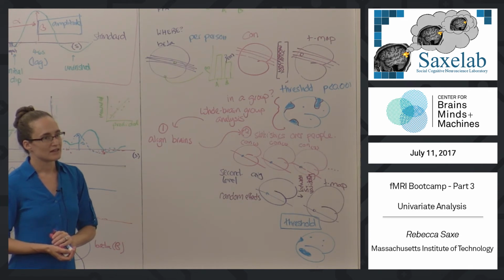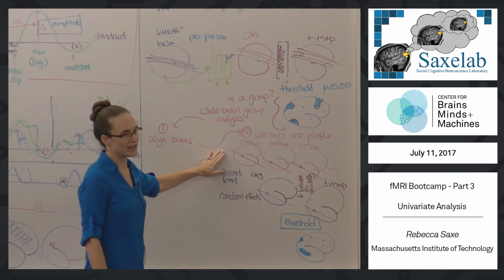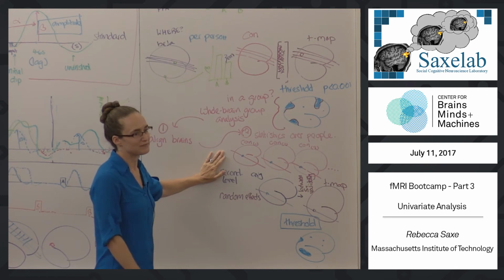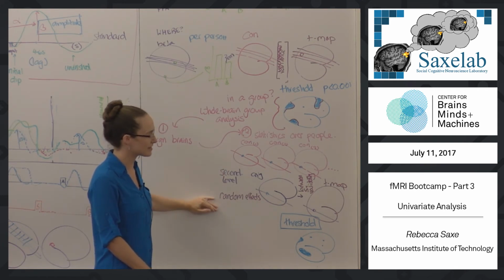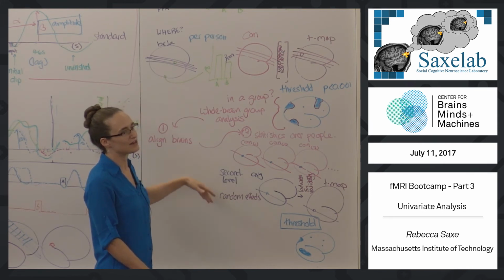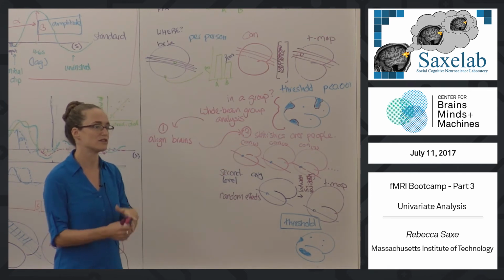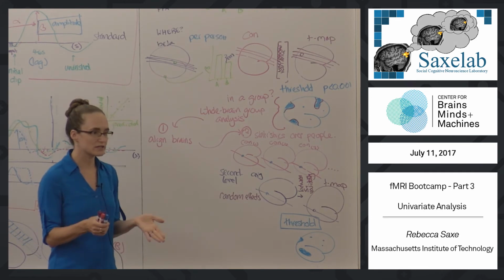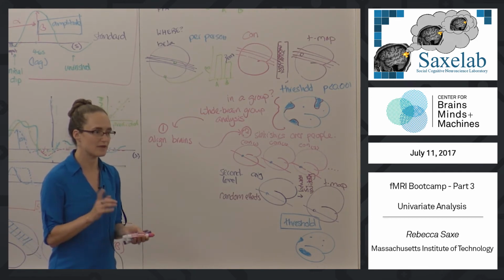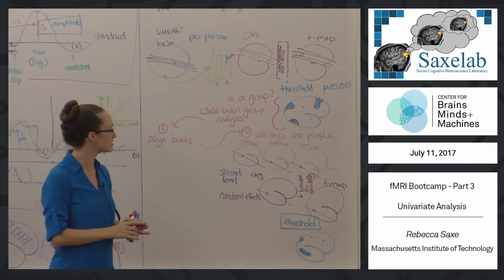This is another question that we answered in that class N years ago. And the answer turns out to be basically that cons are better behaved statistically. They fit a better distribution. And for a random effects analysis, if the beta value was a bad fit, it won't be stable across people. And so the stability across people is the signal you end up looking for. I can go into more details on that if you want. I'm not fully prepped for that because I resolved it for myself many years ago and closed it off.